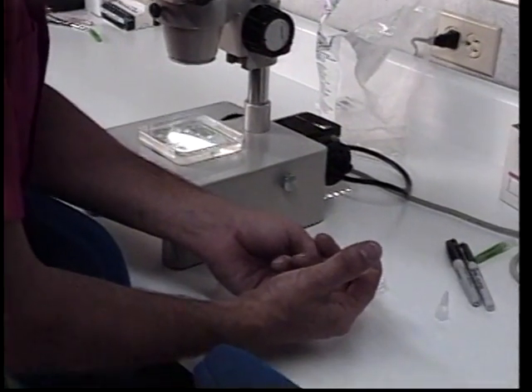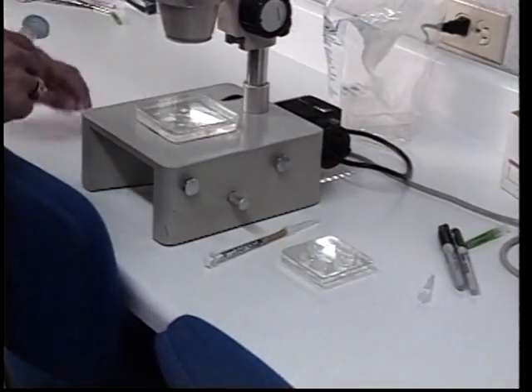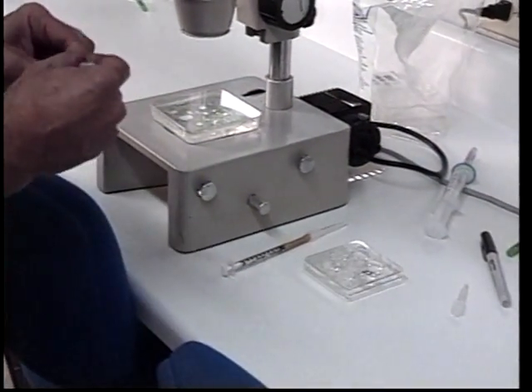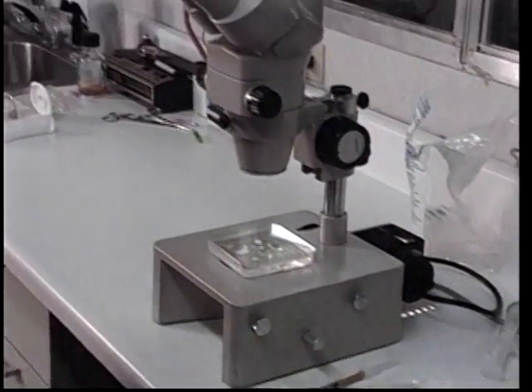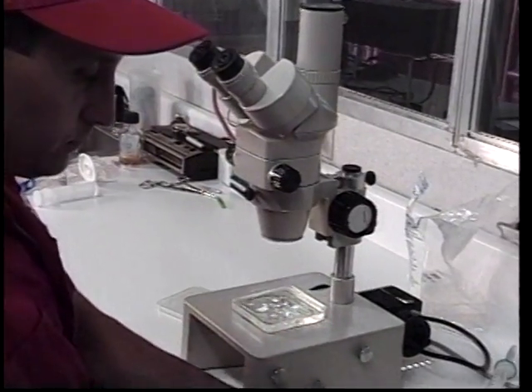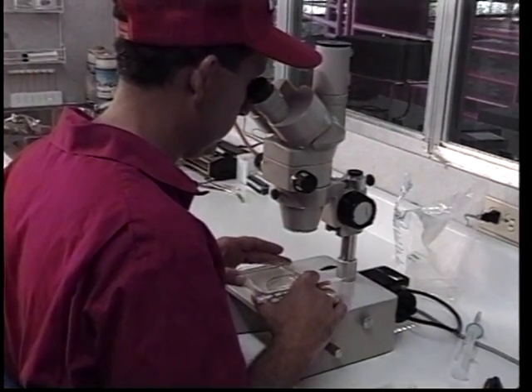Using the holding solution which we prepared earlier, we will now fill up a 6-well dish by inserting the solution through the sterile filter. We then identify the lid of the dish with the cow number. Using a sterile unipet, we would slowly move the air bubbles out of our view, and then we would begin searching for the embryos.